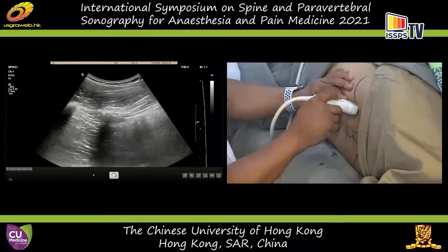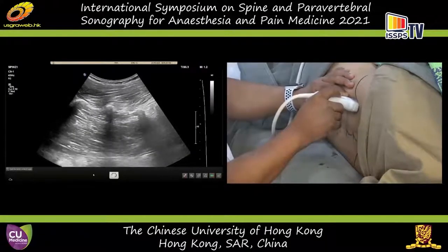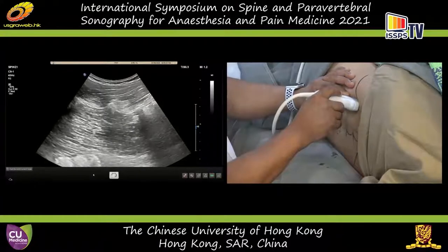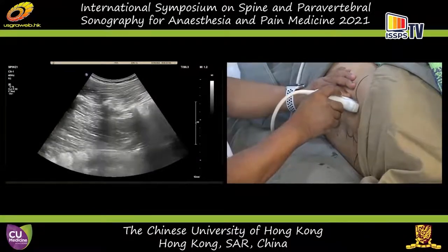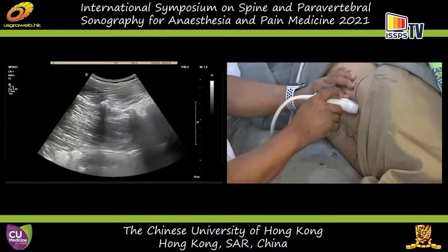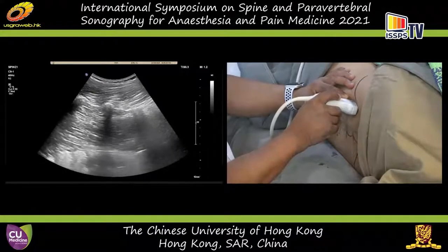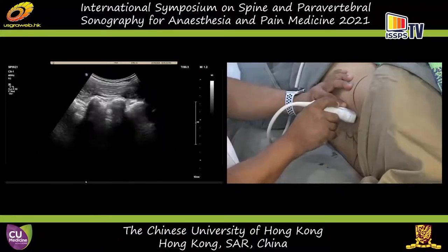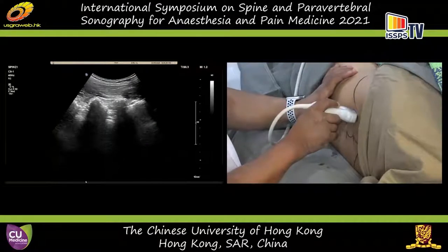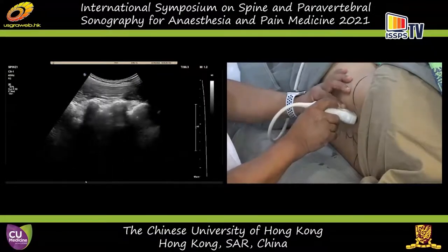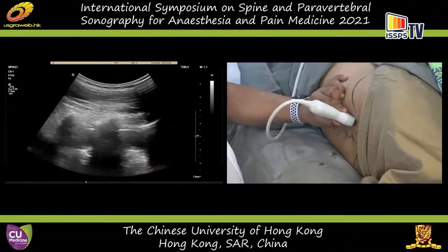You can see the shadow of the psoas muscle — he's got a large psoas muscle there, with some hypo- to hyperechoic shadows within the thick psoas muscle. You can also see the retroperitoneal bowel and bowel motility, and the psoas muscle between the acoustic shadows. We will use this more for lumbar plexus injections. However, if you are performing a neuraxial intervention and you see this structure, it usually implies your transducer is a little bit too far lateral — you need to swing it more medial to see the neuraxial anatomy more clearly.